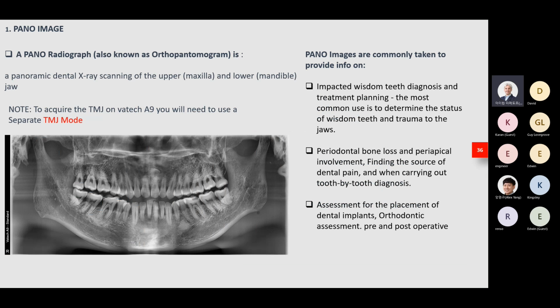For the image section, we put some images here. Most of you may already have experience, and you know what a PANA image is, what a CT image or a CEPH image is. I just added this information so that you can refer to it anytime you want.